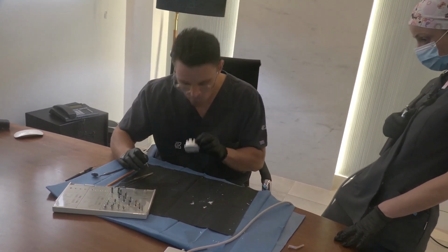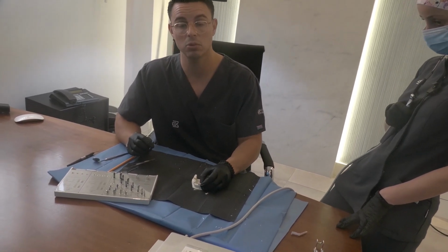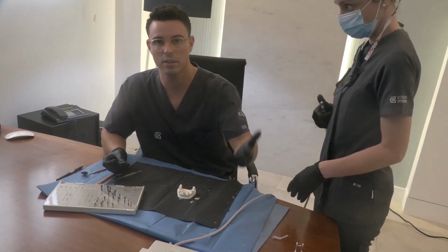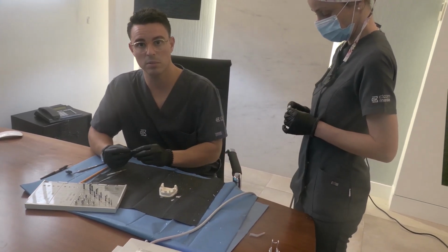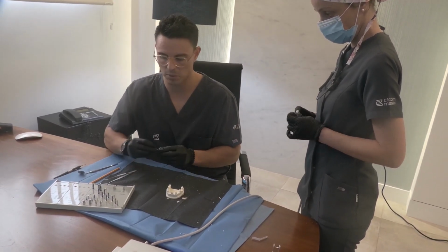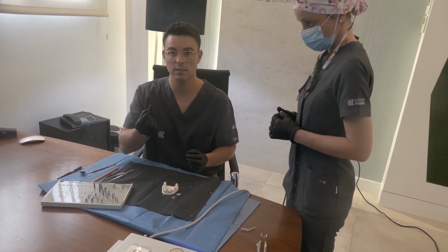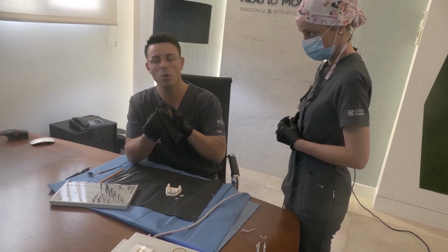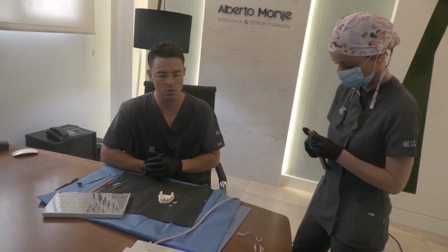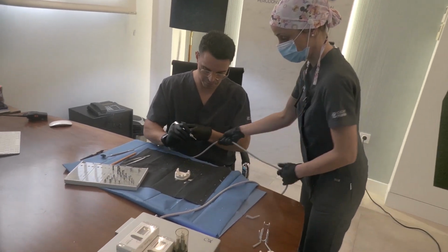Now, if we imagine that we're going to place a provisional prosthesis, it is desired to have a higher insertion torque, not higher than 50 Newton centimeter, but perhaps higher than if drilled with a 3.5 millimeter burr. Therefore, I will compensate for any friction that is triggered during implant position only in the coronal area, and this is the reason why I'm going to move forward towards the use of the profile burr at 100 revolutions per minute.